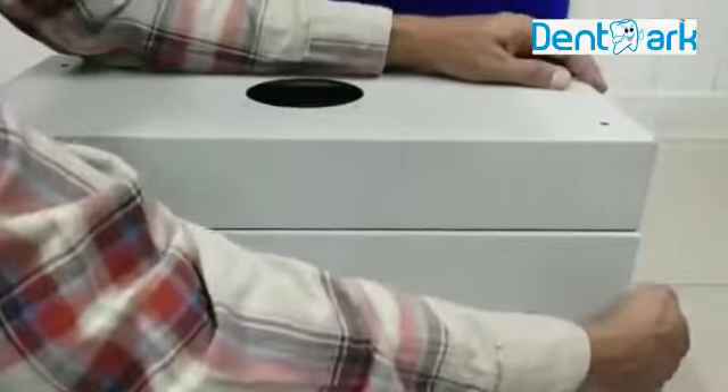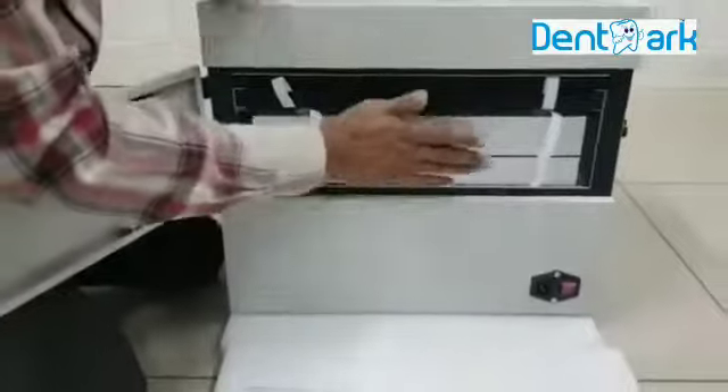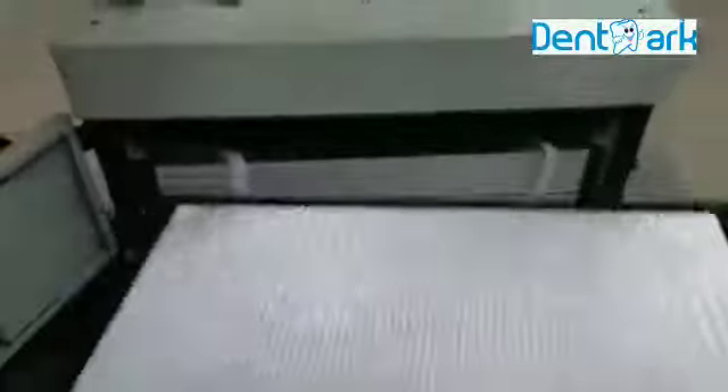This is the back door of the machine. Open this. These are the series of filters. Take the filters out.